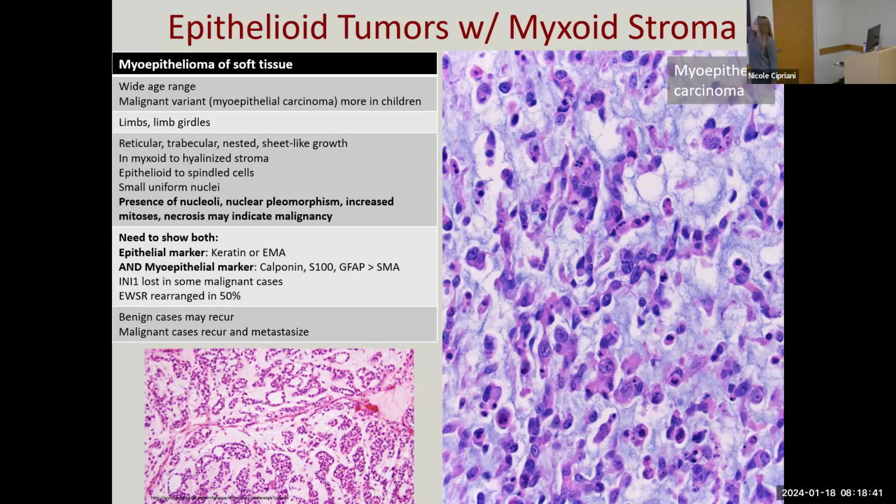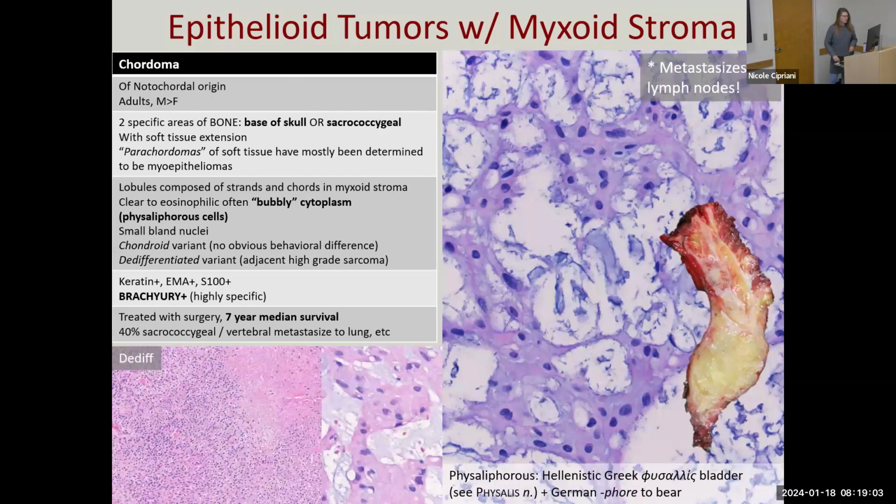So it's apoptoses, mitoses, prominent nucleoli, necrosis. So these are indicators of malignancies in soft tissue tumors, which is slightly different, perhaps, than we are normally used to in the epithelial world. So not invasion, but cytomorphology, and that predicts behavior.